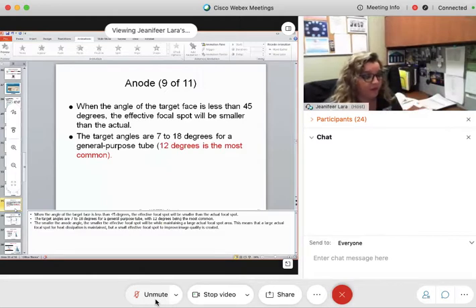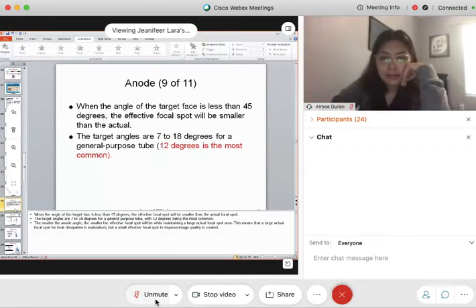How are they different? Electrons are not X-rays. Electrons have a negative charge. X-rays have no charge, no weight, no mass, no nothing. They are bundles of energy. So which one has X-rays in its spot? Effective. Effective focal spot. Thank you.